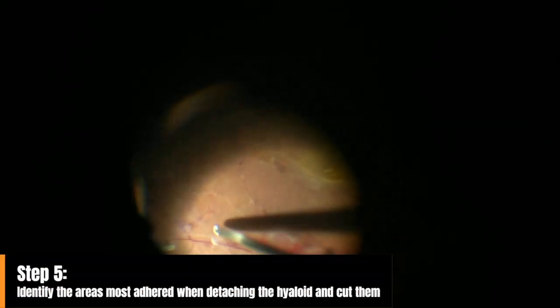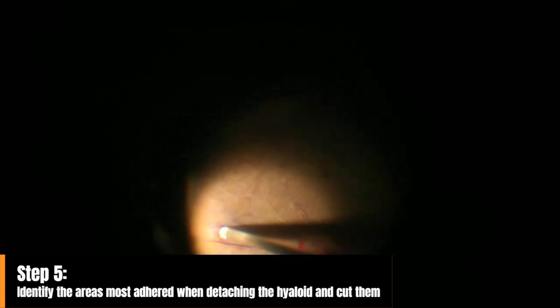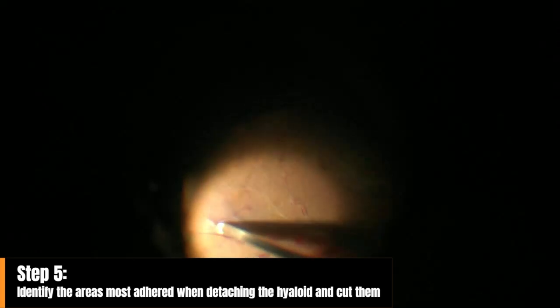Once you have freed part of the membranes at the posterior pole, you will start to see how the next step is to elevate the posterior hyaloid. When you pull it, do it very carefully, as there will be areas where small neovascularizations are attached and you could cause an inadvertent tear. Always identify these areas and cut them before proceeding.